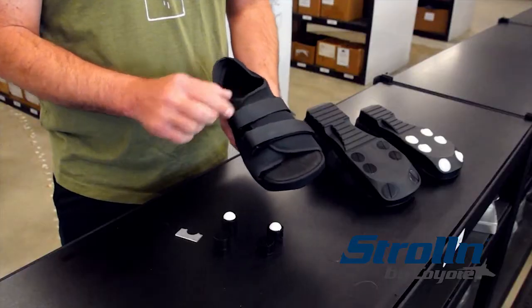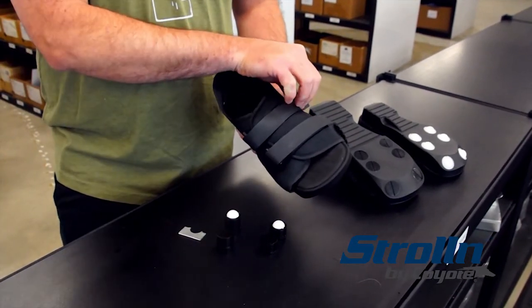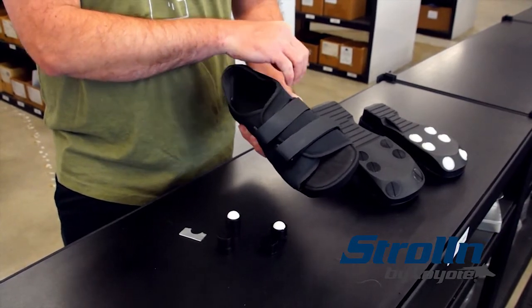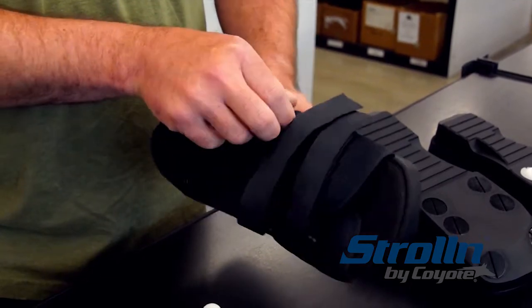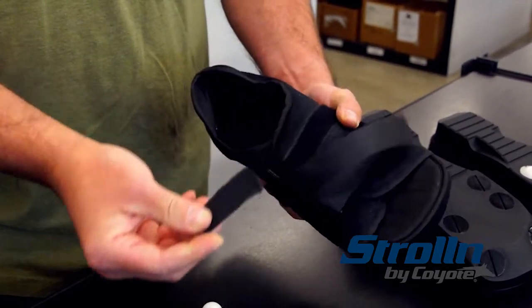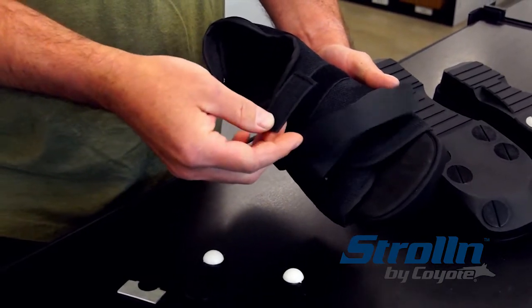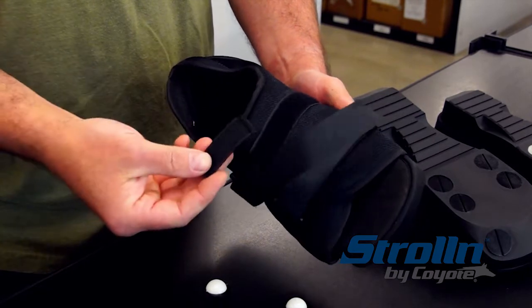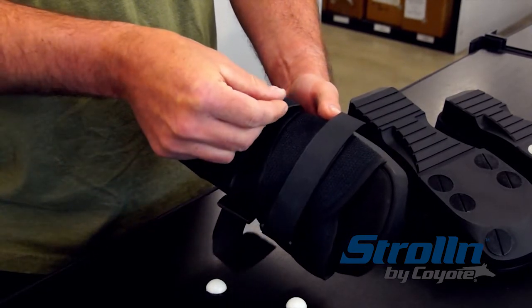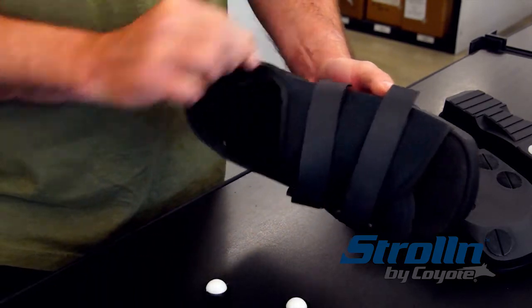But first I'll show you how to adjust the Velcro. When you get your shoe, everybody's gonna have different sizes of feet, but what we've done is we've put a movable piece of Velcro in the straps. So if your person has a really big foot, they can adjust this little piece of Velcro out to the outside, and then they're able to close it.